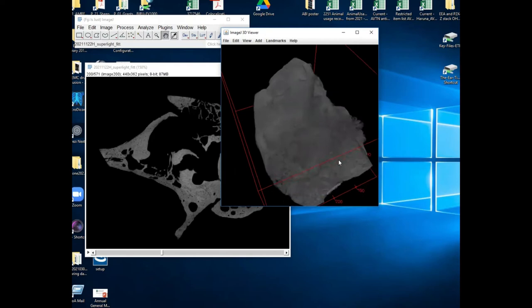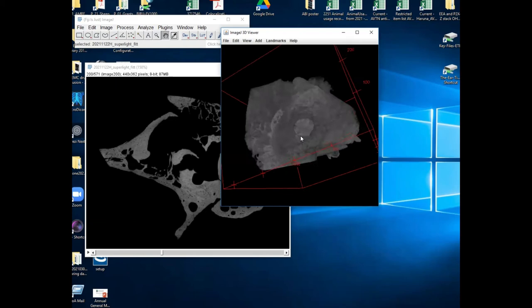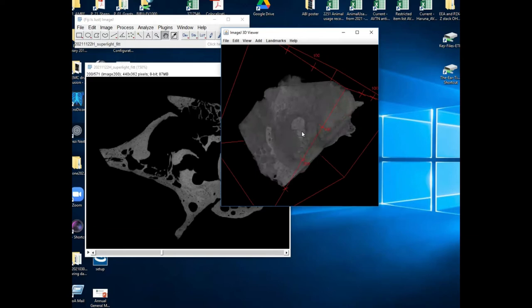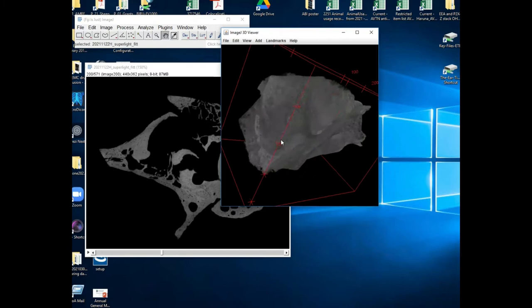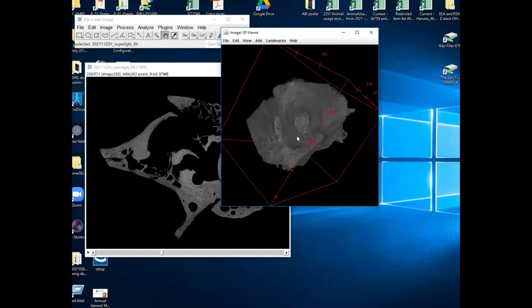So that's the whole specimen. But relative to the whole specimen, the cochlea is just this internal bit, a small size. So that's what it is. But as you can see, once we can find a few landmarks, we'll be able to see where the round window and oval window are, relative to this bony ear canal. And of course, it's missing the skin and the earlobe, so it would look a lot shorter than the actual thing. But it's our own data set we can work on.